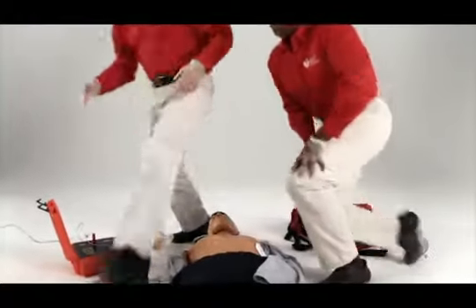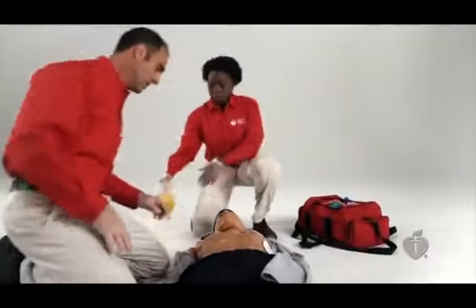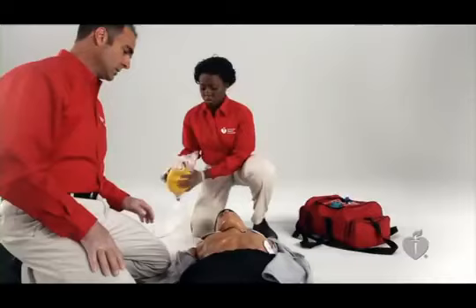Analyzing heart rhythm. Do not touch the patient. Shock needed. Charging. Stay clear of patient. Press the flashing button. Shock advised.